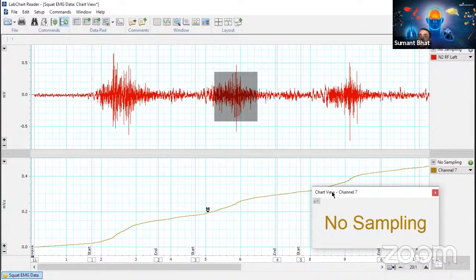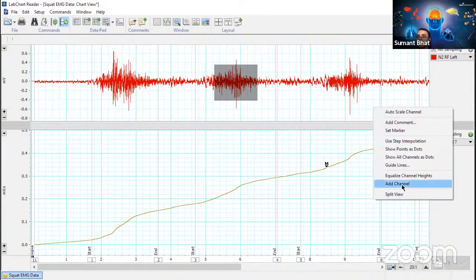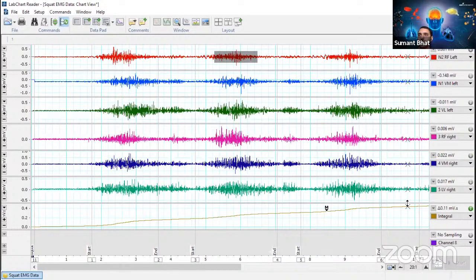Similarly, for the third contraction, say 0.07 — so the first one is much stronger. We can also take this into a data pack. This is one way using integral. We can also go for adding multiple calculations — take one more channel and name it. I request all attendees to try adding a channel and derive an integral parameter so that you will feel comfortable with the settings.